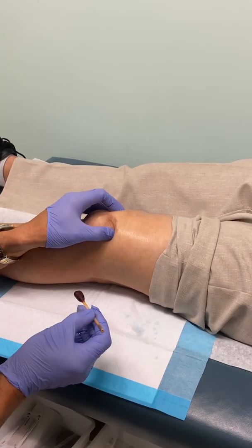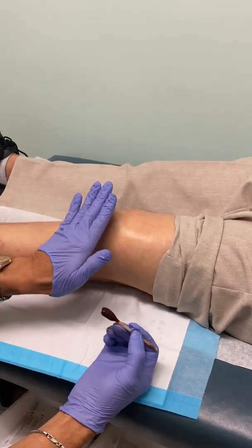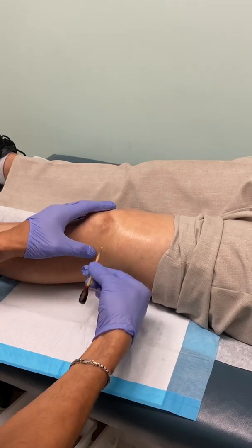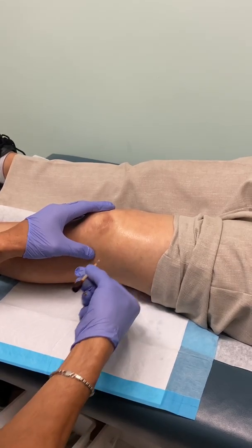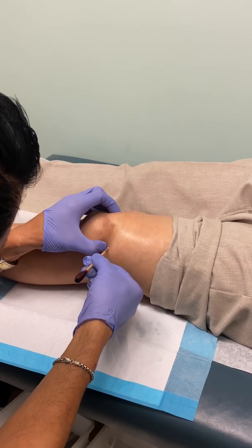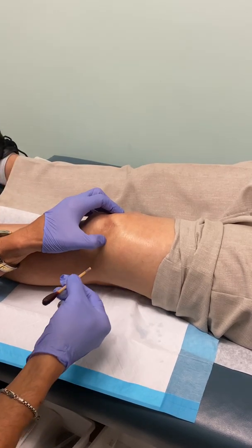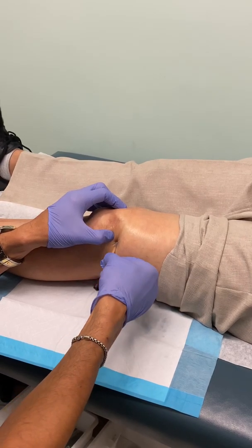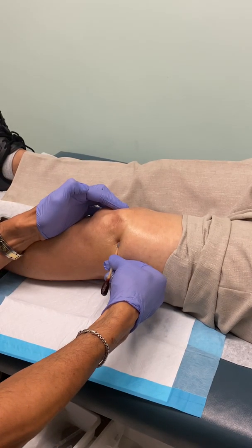Now some patients who have arthritis in their knee, the patella actually tilts like this. So the needle has to be aimed up instead of in. And you have to be able to find the lateral border and stay away from it because you don't want to hit bones. So here's the border — I'm going to go here and aim my needle up like that. Can you see that?